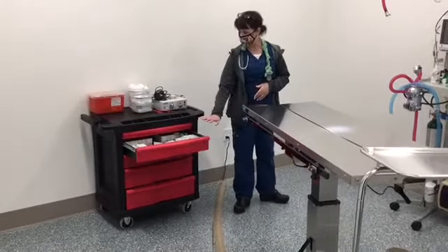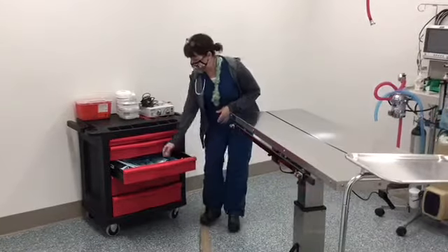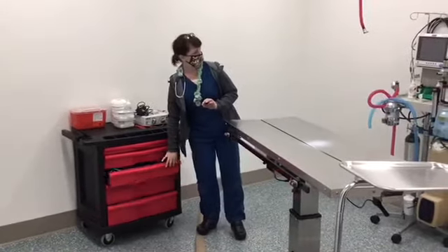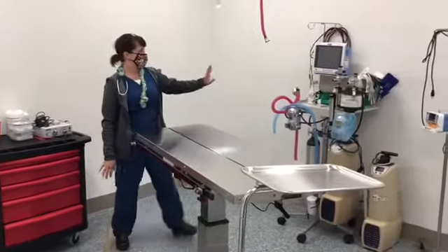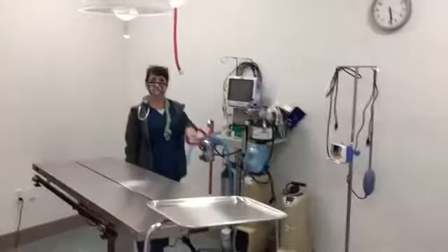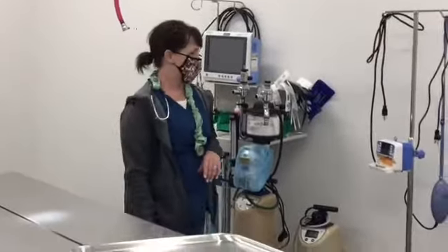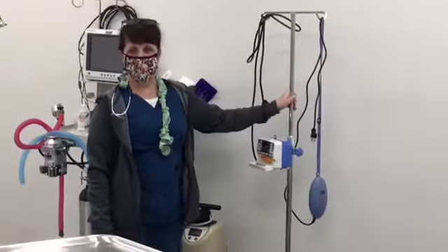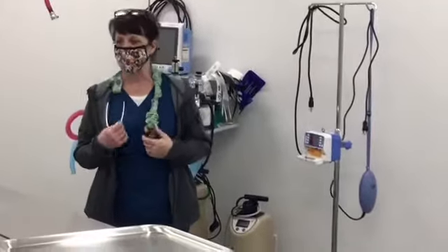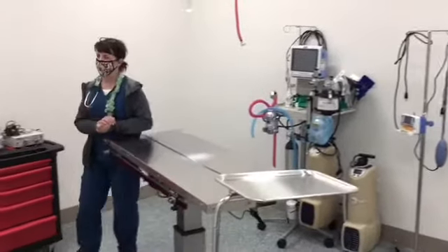We have some needles and suture. I have some drapes and instruments that are placed in sterile pouches. So if the doctor needs to use something like that, it's in these drawers. The monitoring equipment here, so I monitor heart rate and respirations and make sure the patient is doing well while they are under the anesthesia, sleeping during the surgery. I hook them up on IV fluids, so this is an IV pump, and the fluids are for the patient. They get them during the surgery so that they can stay well hydrated.